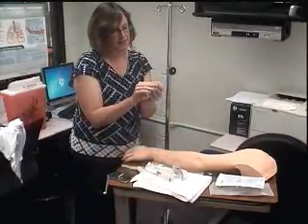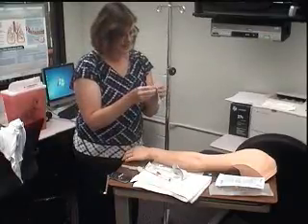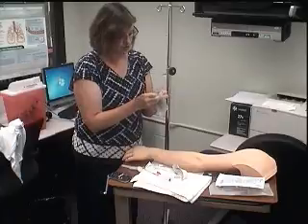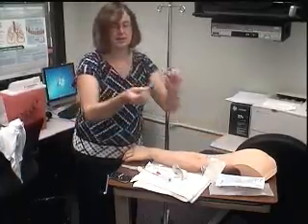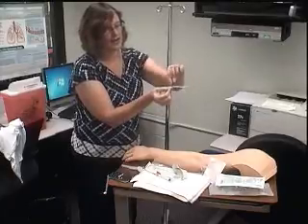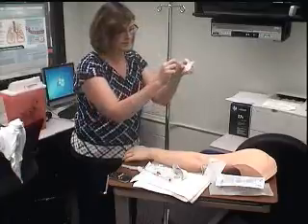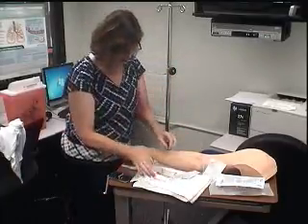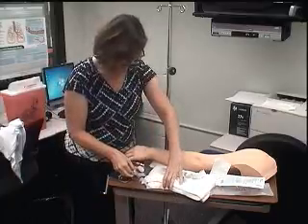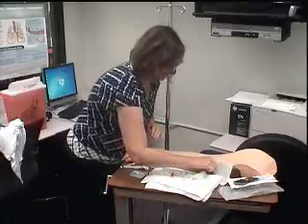I'm going to take my Tegaderm out of the package. Make sure you read the Tegaderm to see how you put this dressing on. With a dressing like this, the back will come off, and then we'll take the green off and then the blue off. But it tells you on the back, step by step, how this dressing works. They all work slightly differently. So I'm going to have my dressing, and I'm going to put this over here for a second. I'm going to use that last.